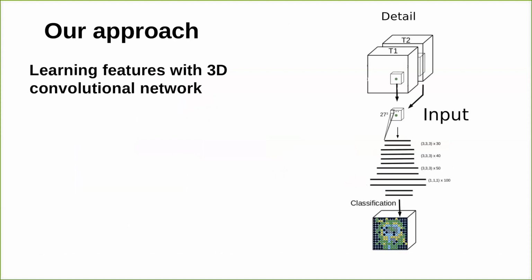So this is a very basic three-dimensional convolutional neural network. This is going to be the backbone of the models that we're using. It takes as an input an MRI, and the specific input is a small high-resolution volumetric patch from within the MRI. After processing through several convolutional layers, the output is the prediction for the class label of the center voxel of this patch. After processing all non-overlapping patches, we get the final segmentation of the whole image.